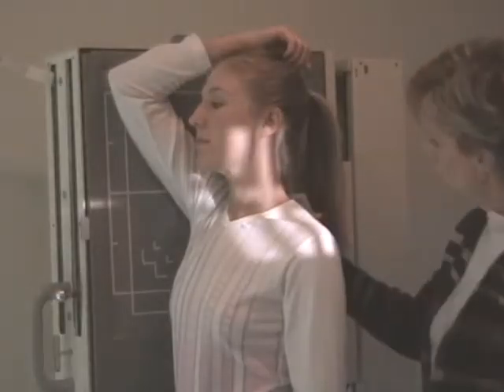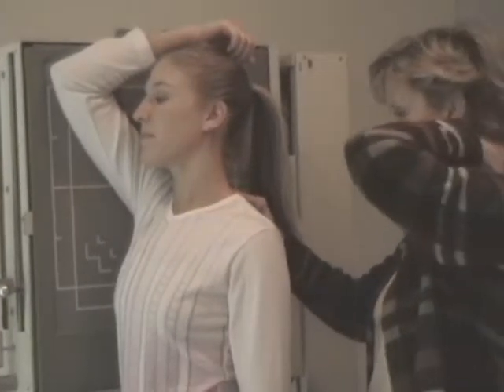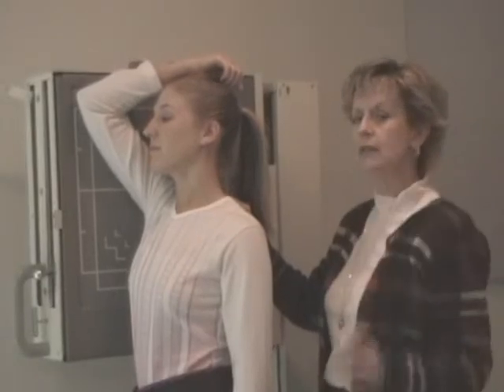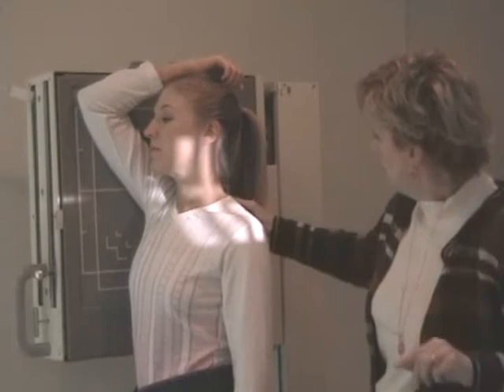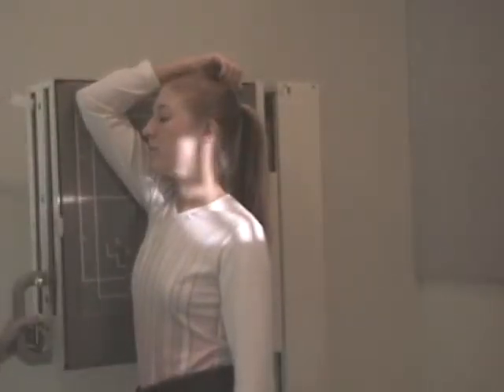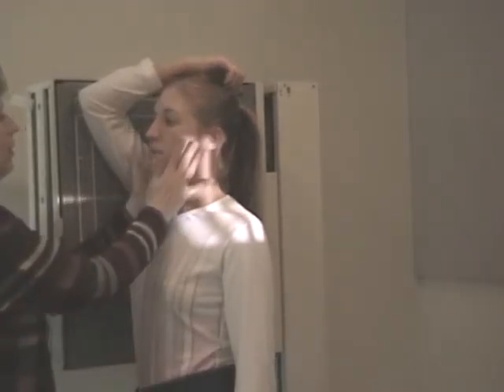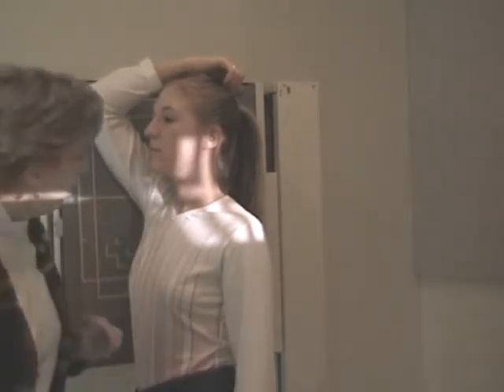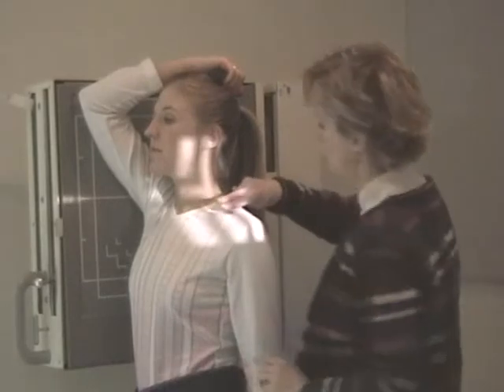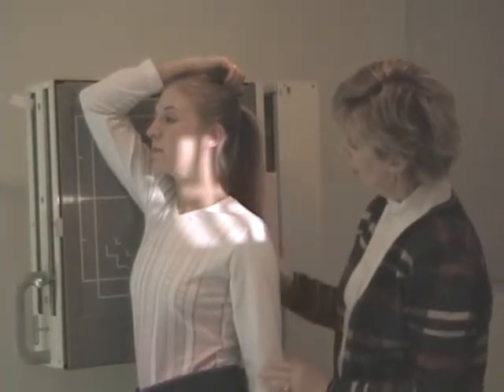You can feel for the cervical prominence. The bump on the back of your shoulders, feel for it. The one that's most prominent is C7. That's where I want the crosshair coming down through. Okay, right there. And so I'd fix the vertical board to match. And then you look at the patient's face because you want them, again, straight and not rotated. Now, I want you to focus right here on this crosshair too. Again, it's coming in at C7. And we're happy with that.